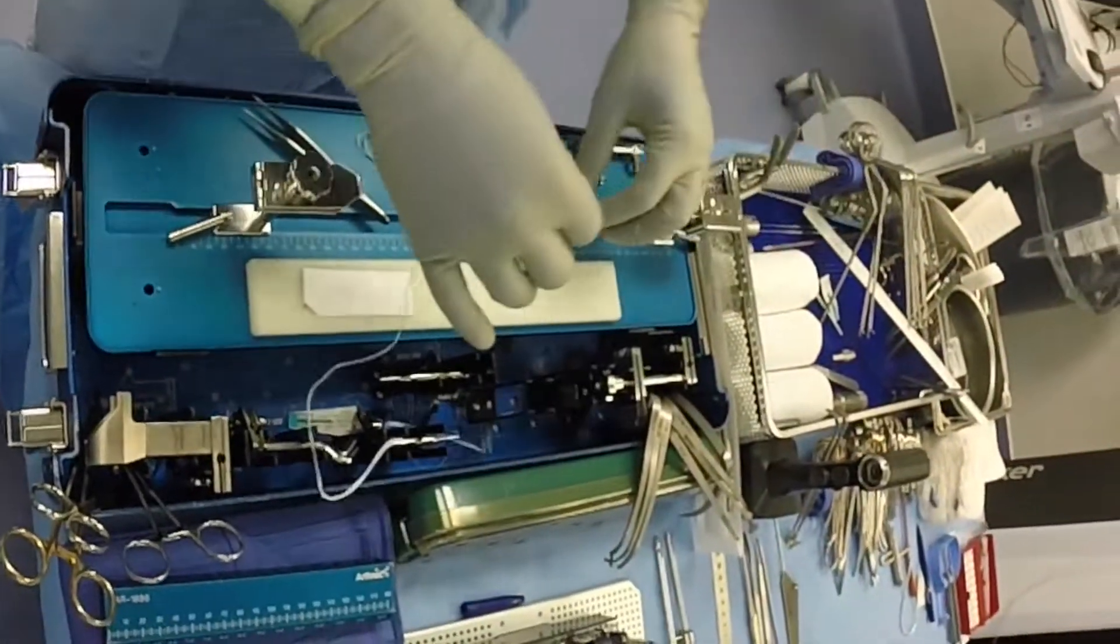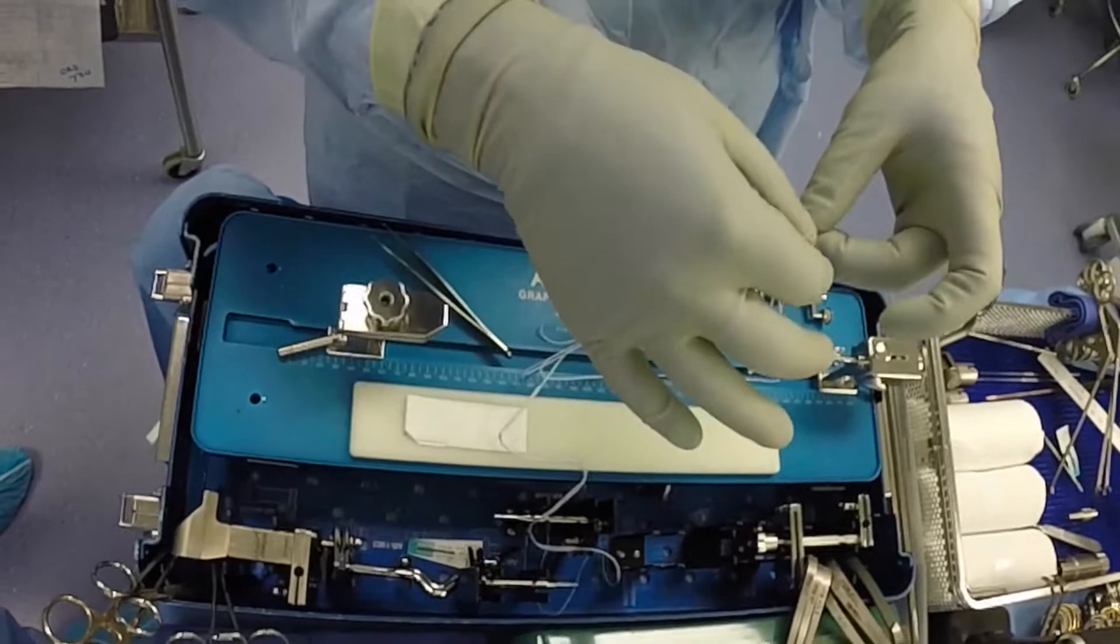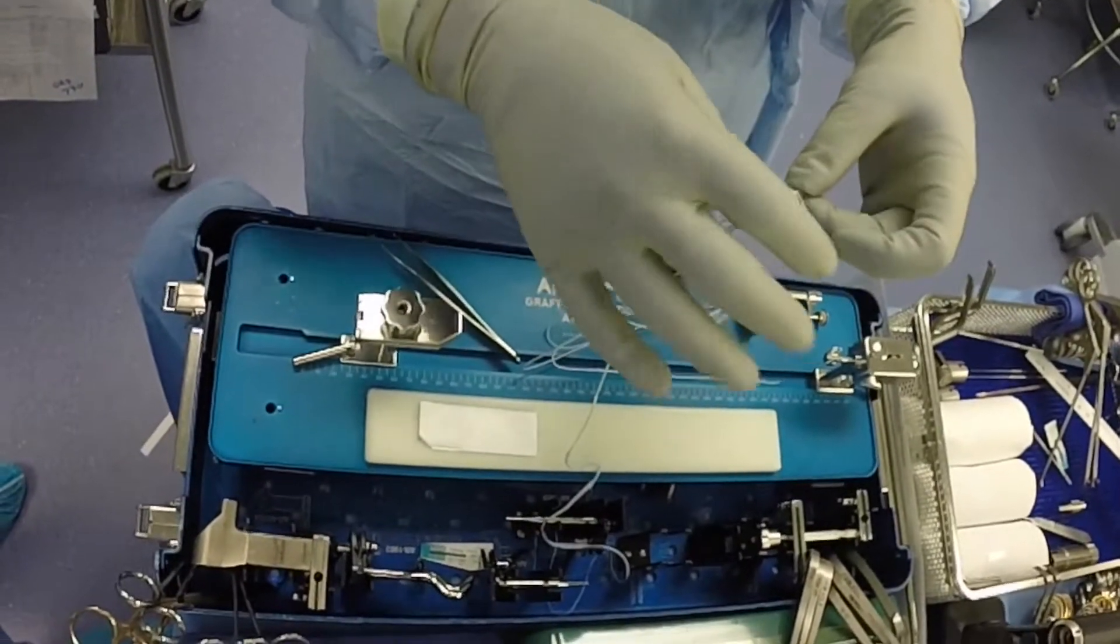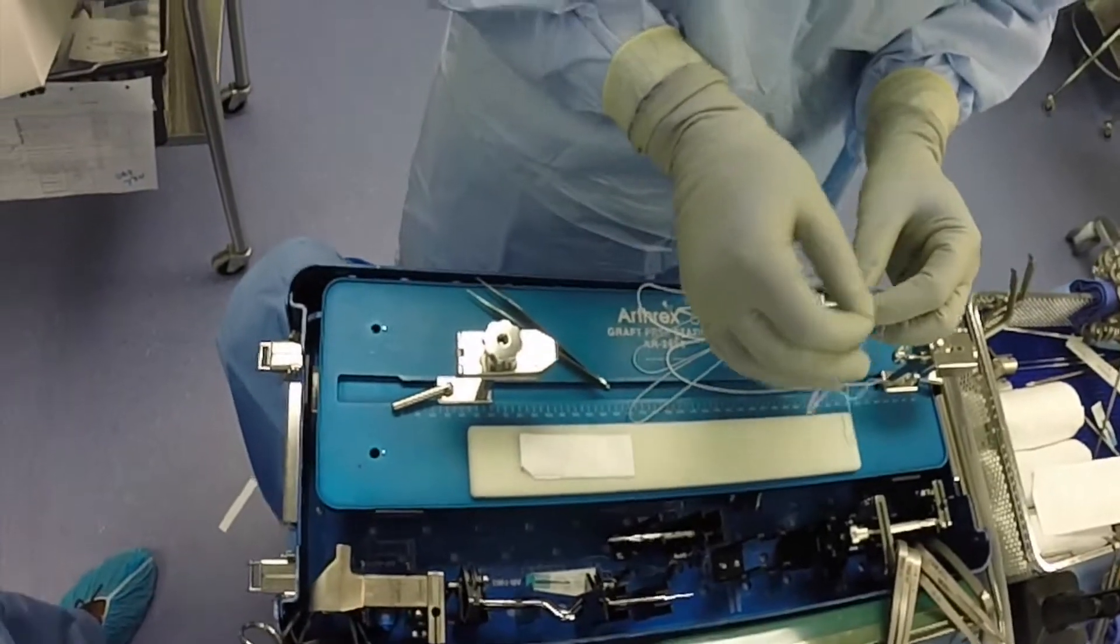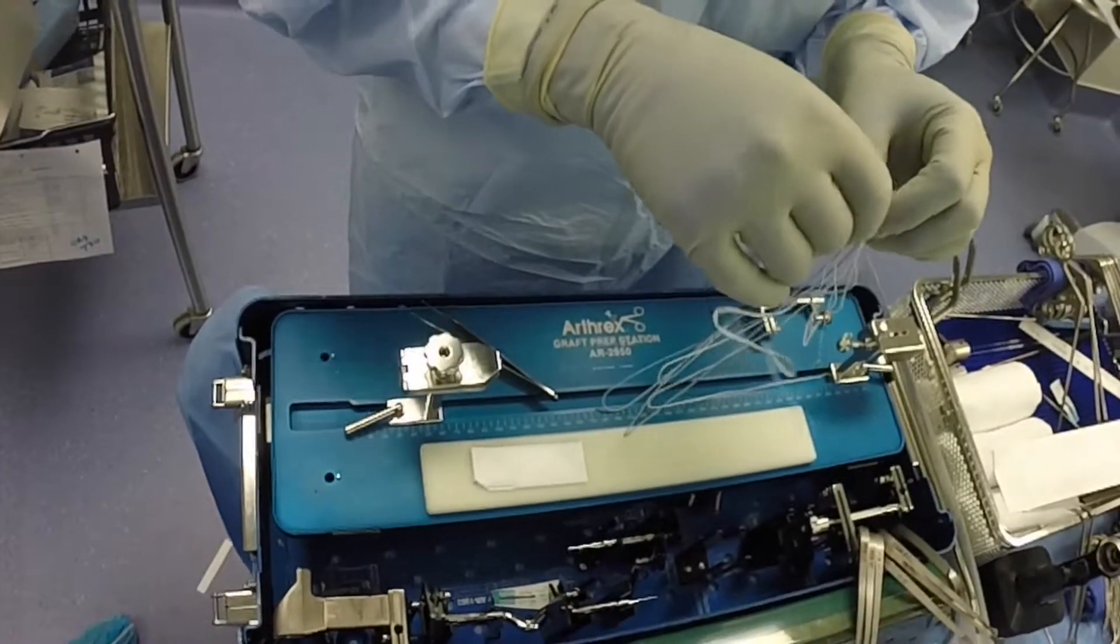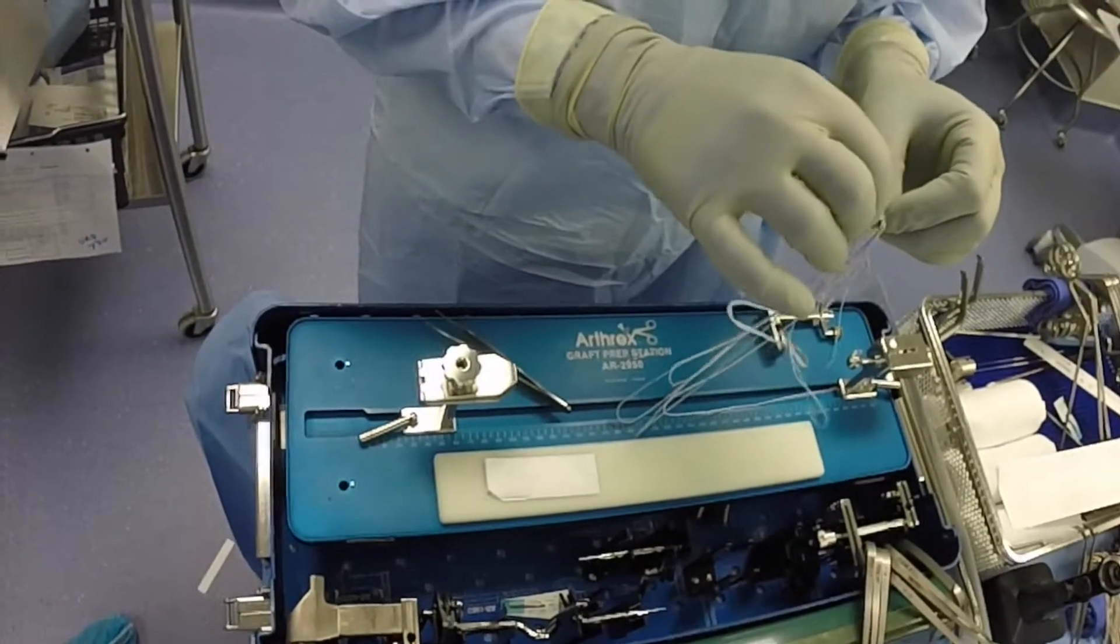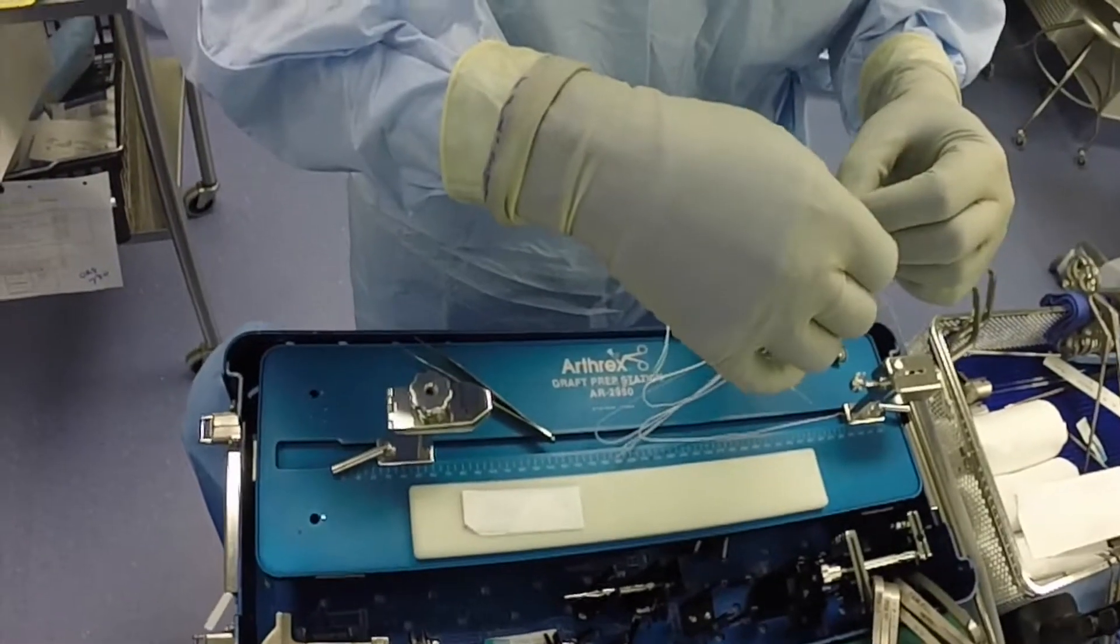In this case, a collagen-coated tape is then passed through the button on both sides such that the tails exit the same side as the loop portion of the suspensory fixation device.